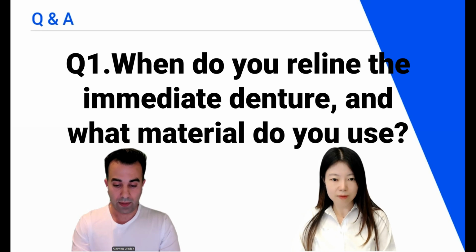And once the swelling starts to go down, the denture will start to become loose. At that time, the patient will be using denture adhesive cream to keep the denture in place during the day to provide some retention.